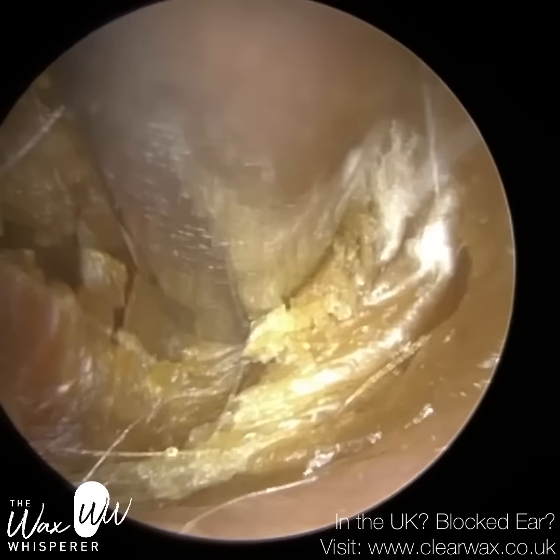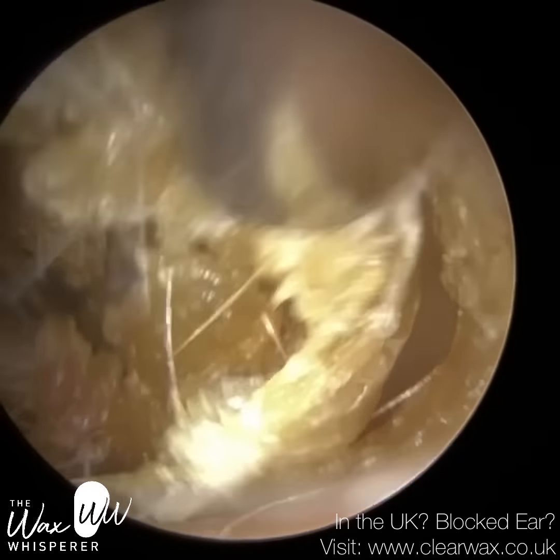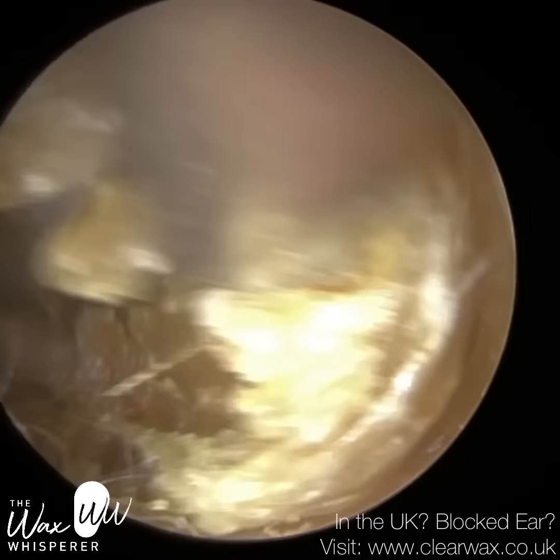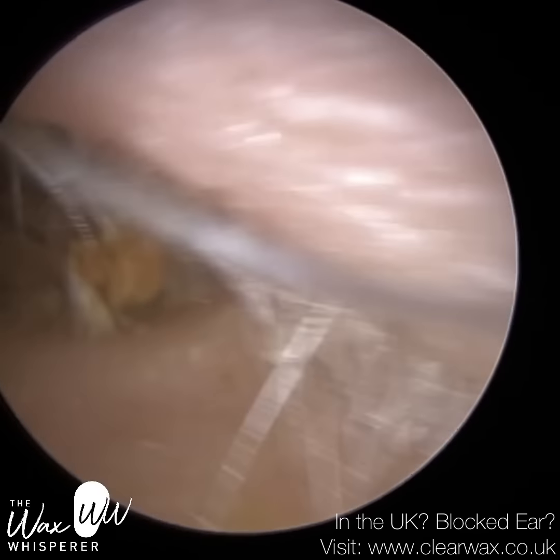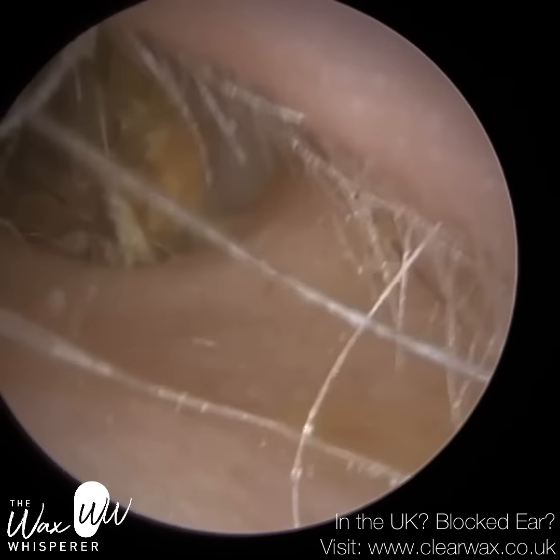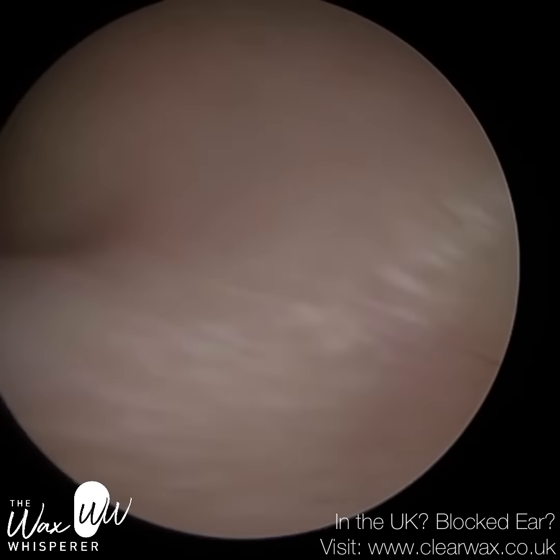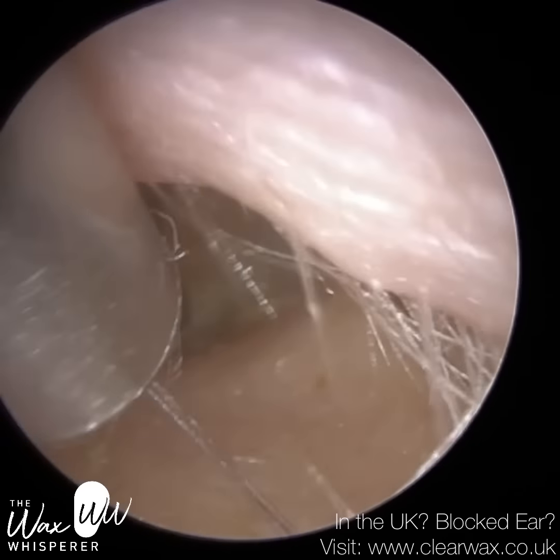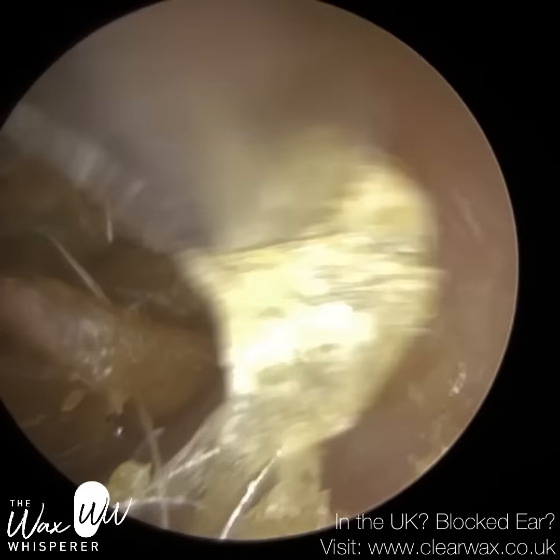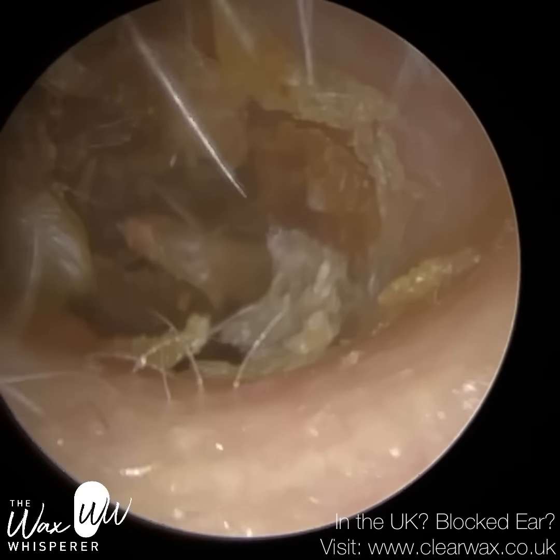So dead skin keratin is very glossy in appearance, and that's because the protein keratin that is contained within the skin has this reflective property. So one way of differentiating between earwax and skin is by looking at the complexion. Whereas wax is more likely to be matte in appearance, dead skin is likely to be more glossy.